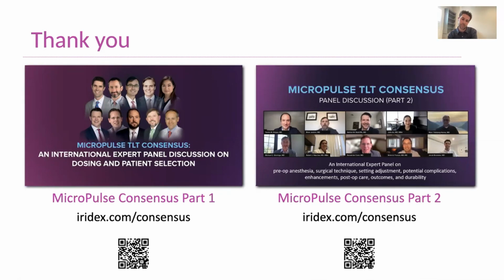I agree with basically everything that's been said, but to echo Brian, it's a completely different procedure. The big thing I've learned in this process is, one, to be more consistent. Sometimes it's just, well, these are the numbers, just sweep back and forth. I think we have to be a little more diligent about how we do the therapy, where we're placing it, the coupling agents, the speed. All of that is really crucial, and we should be more meticulous rather than thinking, I've got this, I'll just do whatever I do. By being meticulous, we're going to have better results.